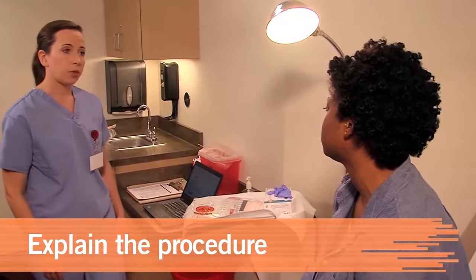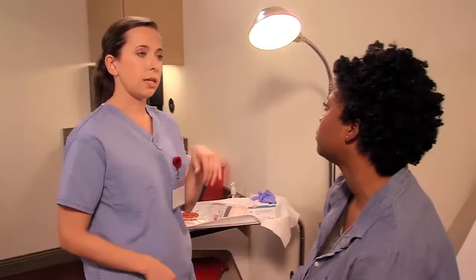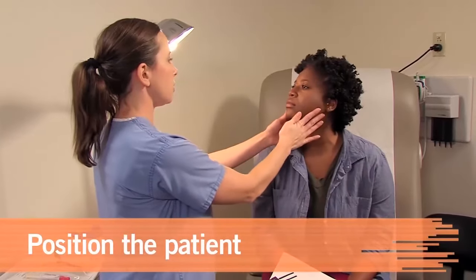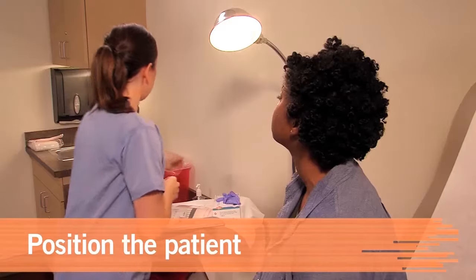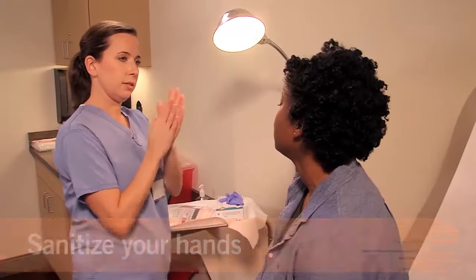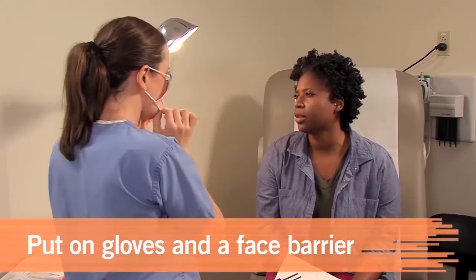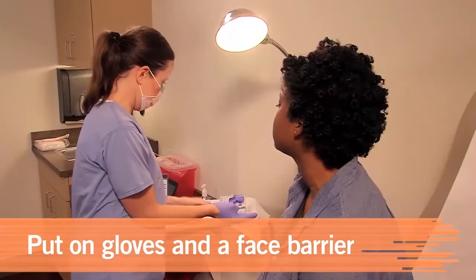So we're going to be doing a throat swab today. I'm going to be using this light to look in. Position your patient so that the light shines into her mouth. Sanitize your hands, then observe standard precautions by putting on gloves and using face protection.